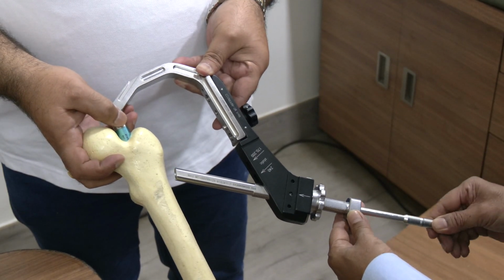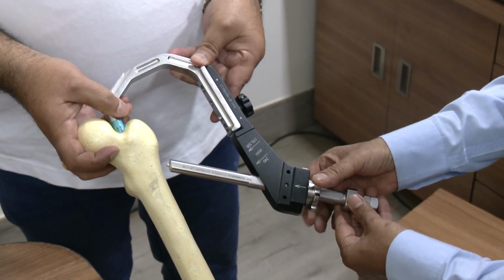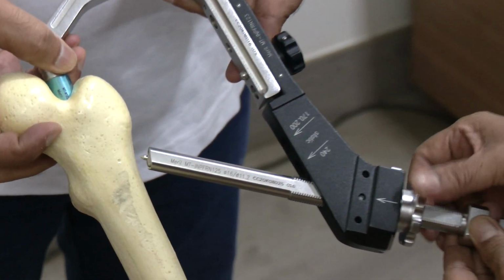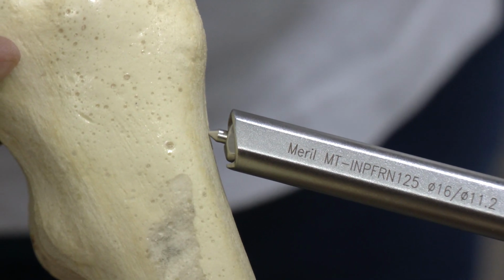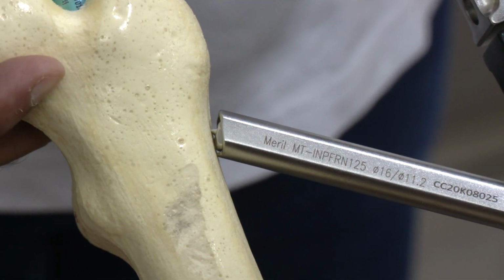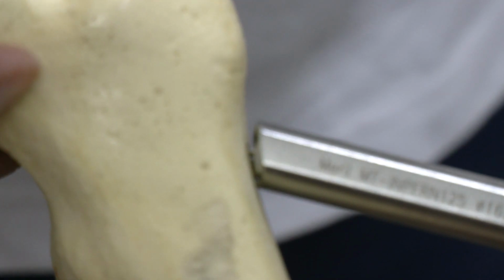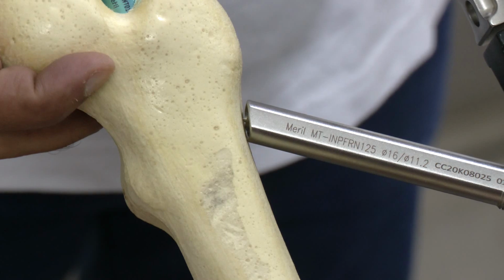So I am using this now. What you have to do is, after having passed this, you keep on tightening this turnbuckle. You can see that the gap here becomes less and less, until it touches the lateral cortex, and you keep on pressing with this. Because it is latched here properly, it won't come out. It sits properly. All the soft tissues are pushed on either side in this fashion.